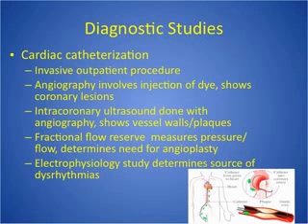Now, cardiac cath. Cardiac cath is very important for you to understand. I always ask my students questions about cardiac cath because we see them done so often. This is still considered the gold standard for coronary imaging, and it is invasive, typically outpatient, and it involves insertion of a very large catheter, like a garden hose size, not really that big, but it would feel that big probably, into the right or the left side of the heart. So they can sometimes use an arm vein, but they typically use the femoral vein.